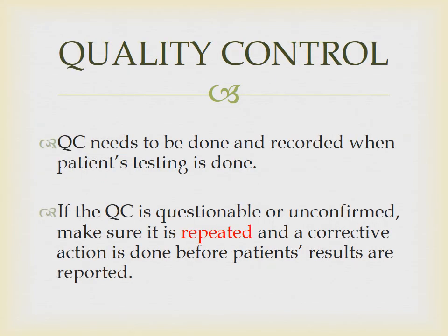QC needs to be done and recorded when patient's testing is done. If the QC is questionable or unconfirmed, make sure it is repeated and a corrective action is done before the patient's results are reported.